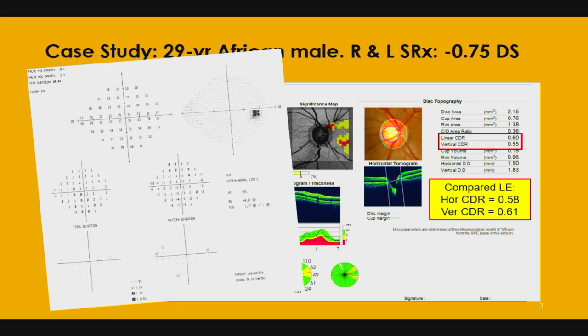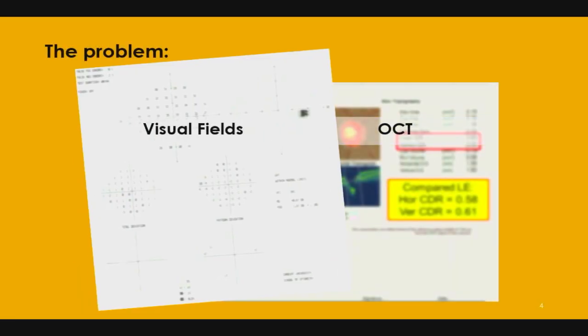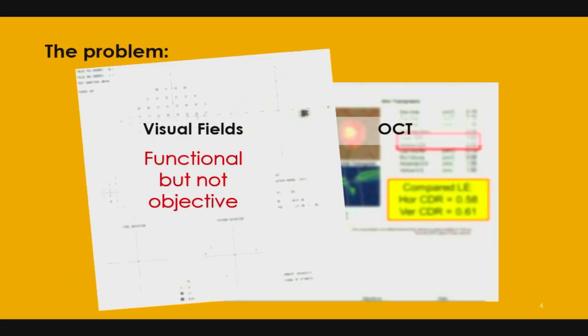I think this was minus 2 something. That's what your mean deviation is looking like. You've got these uncertainties here, one around the blind spot. What are you going to do about it? Do you refer? Do you monitor? You are just going to monitor, yeah. But it would have been cool if you could tell definitively what the issue was.